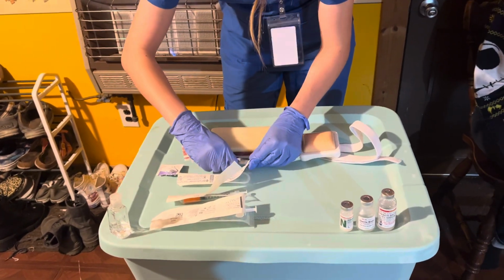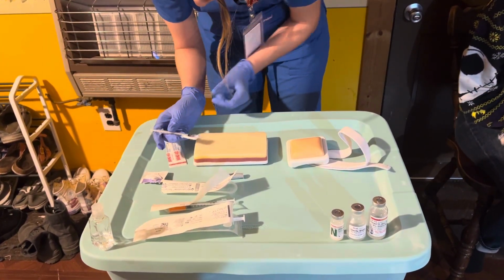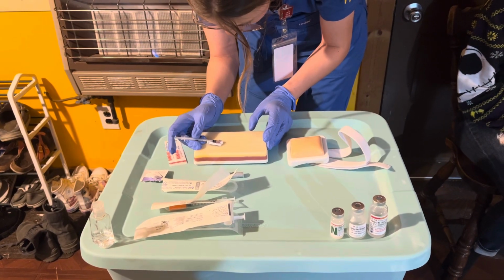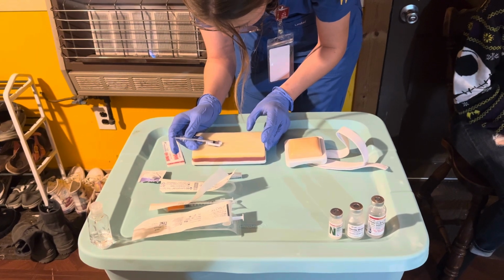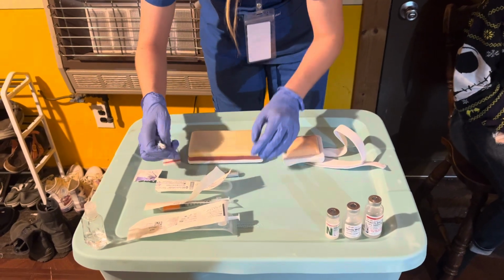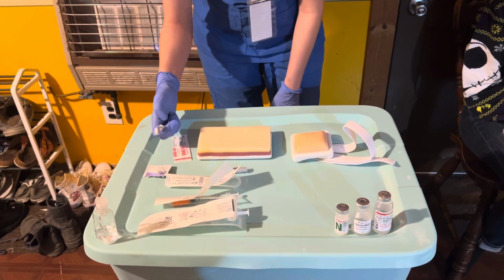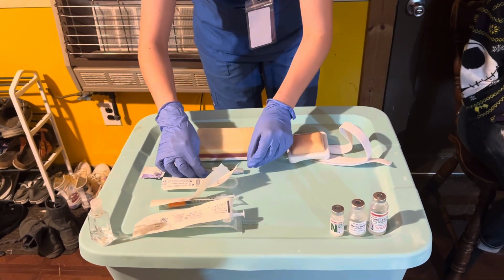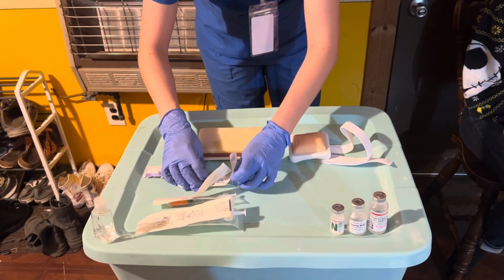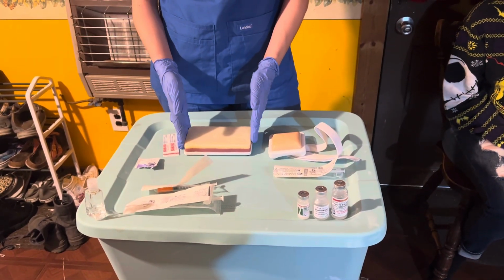So I've cleaned the site from in to out with an alcohol pad, and I'm going to make sure I insert this needle bevel side up. I'm going to go in at a 5 degree angle, inject my medication, pull the needle out at the same length. I would make sure to instruct the patient not to massage the area. I would engage my safety and dispose of it in a proper sharps container, but for educational purposes, I'm recapping my needle. Alright. So I would come back after the appropriate amount of time and evaluate the response.